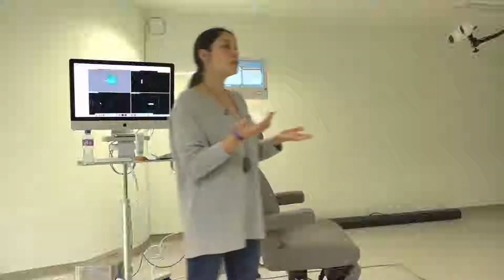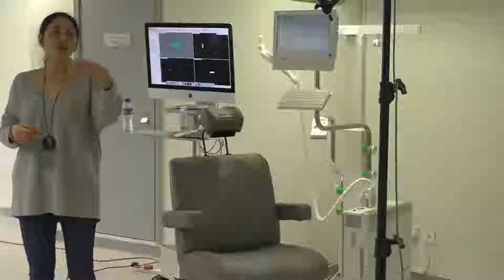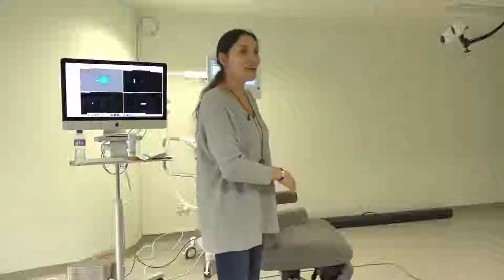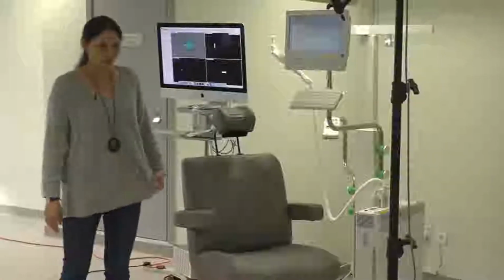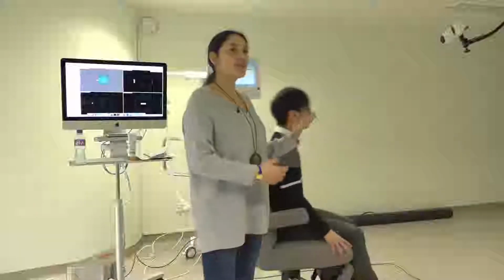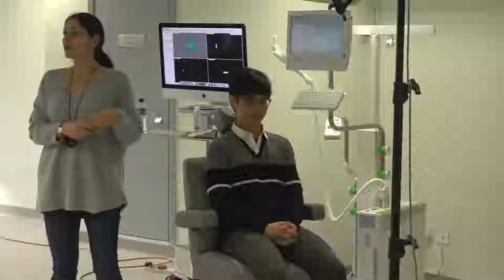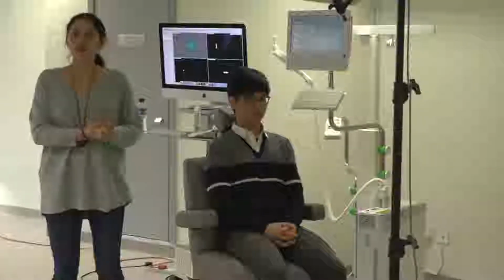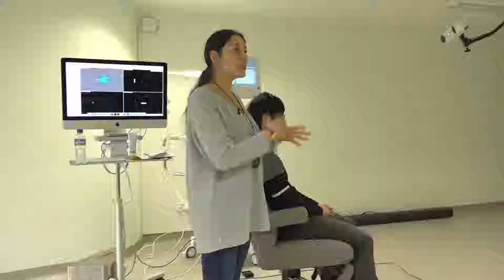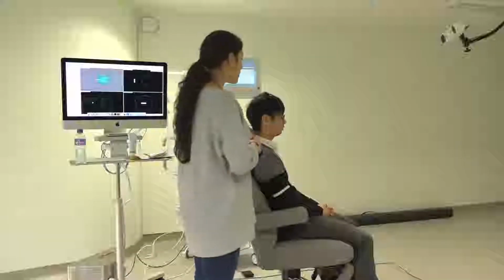In the first session, what you need to do is to find the thresholds, apart from the consent form and everything. So I have here my lovely assistant, Joseph, who will be our example person. Come, please, Joseph. I already did the consent and the TMS questionnaire. He is suitable, and he has signed for the job. We have also been working together to prepare this for today, so he is an experienced person.